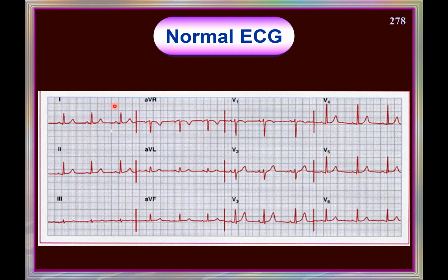Without the standardization, you should never present the ECG. It is implied here that the standardization is normal. Otherwise, they would have mentioned it is half standardization or double standardization. You have to write it with a red pen on the ECG. If it is full, you don't have to. If it is double or half, we have to indicate. Okay.